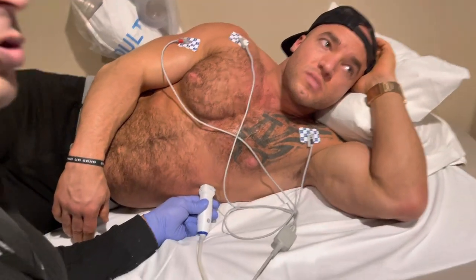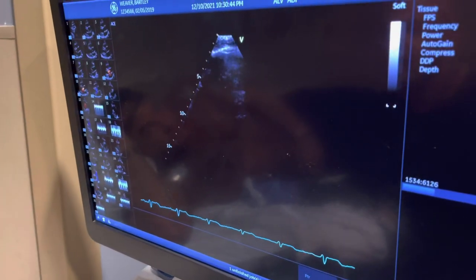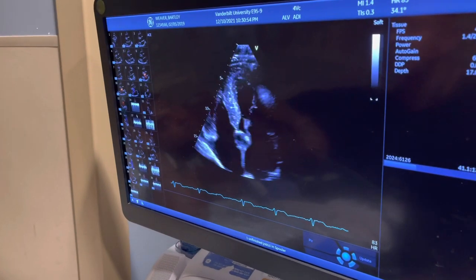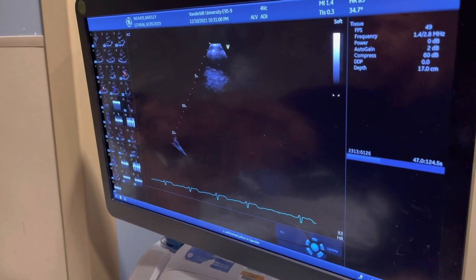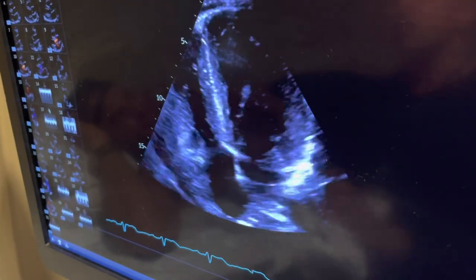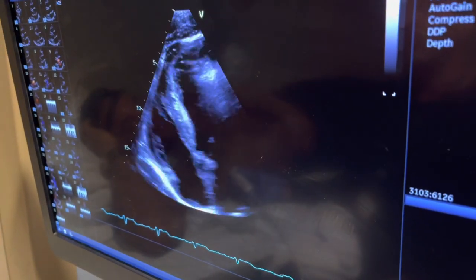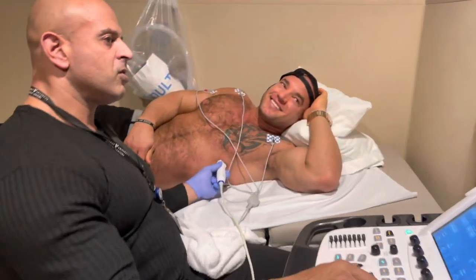Take a deep breath, hold it for a second — and let it out, just breathe normal. So what happened — your lungs are above your heart. Air and ultrasound don't work well together. When you take a deep breath, the picture disappears because your lungs fill with air and cover the heart. Let it out — here it is! You see the difference? Wow.